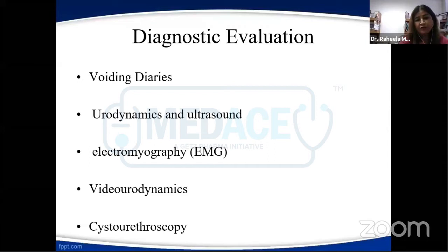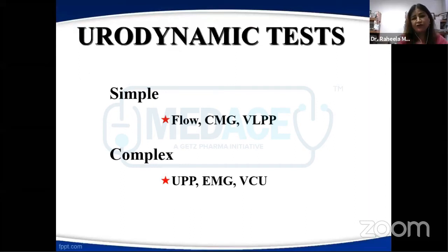Urodynamics, so that's the main topic. When do we do it? In combination with EMG, yes, with pelvic floor disorders I always do it. Video, sometimes, yes, with congenital anomalies. Cystourethroscopy after or before urodynamics, that's a big question mark. But I know my urologist colleagues would love to have cystoscopy before urodynamics. So that's just the practice.